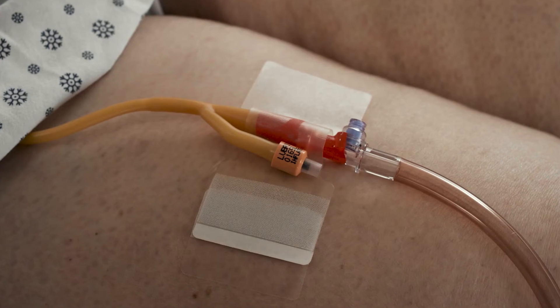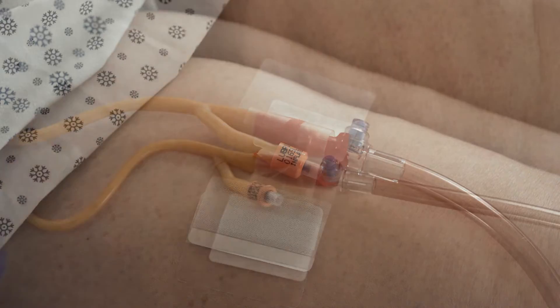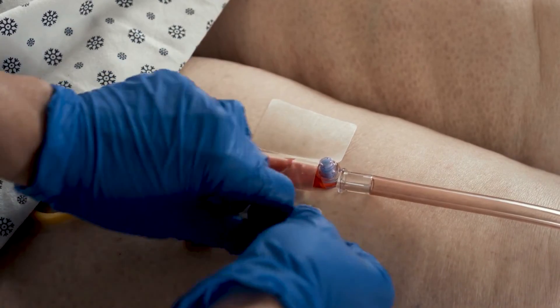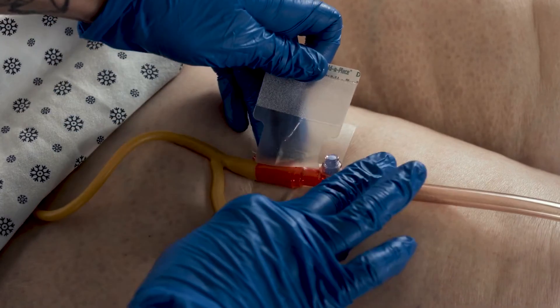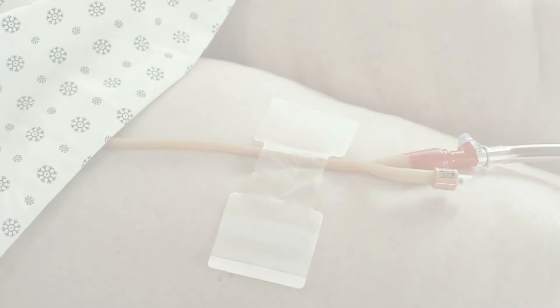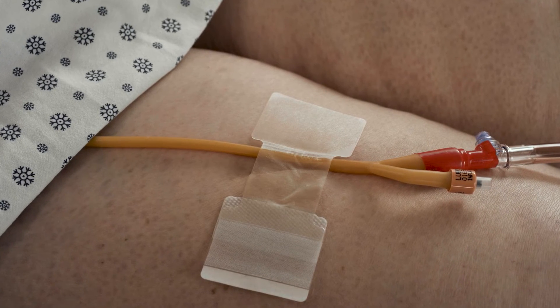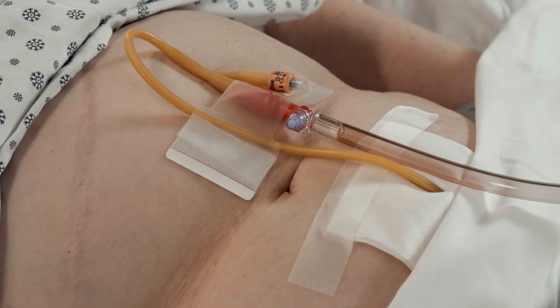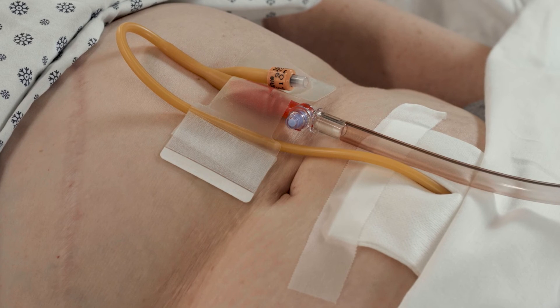Leave an ample loop in the Foley catheter above the holder to avoid bladder traction. Adjust the tube if necessary. Alternatively, the urinary catheter may be secured above the Y port. The device can also be used to secure a suprapubic catheter and drainage tubing.